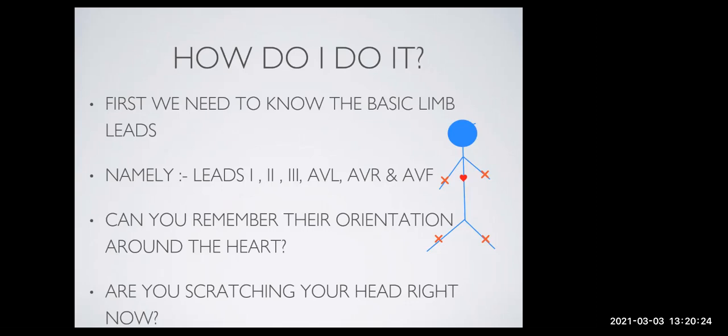Right, the heart is there. Each lead around the body is looking at the heart from its particular point of view. So that's essentially what we're trying to do here, get a point of view. So what I want to do, let's just put the others.